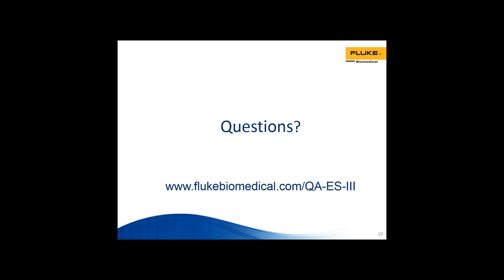So 1 year is our current calibration cycle, especially including QAES3, and we recommend that you always send your test equipment back to its original manufacturer or their authorized service center, because you will get the best results out of your calibration, and any hardware or firmware updates that need to have been included prior to any adjustment that's made, should an adjustment be required.